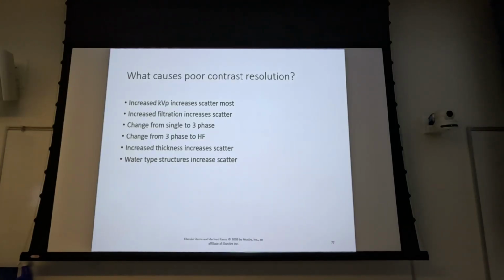So there's no real reason. I mean, if somebody were to do an exhaustive study on it and determine that increasing the kVp by another 15% wouldn't have any kind of ill effects on contrast or diagnosis, there's no real reason why we shouldn't, right?